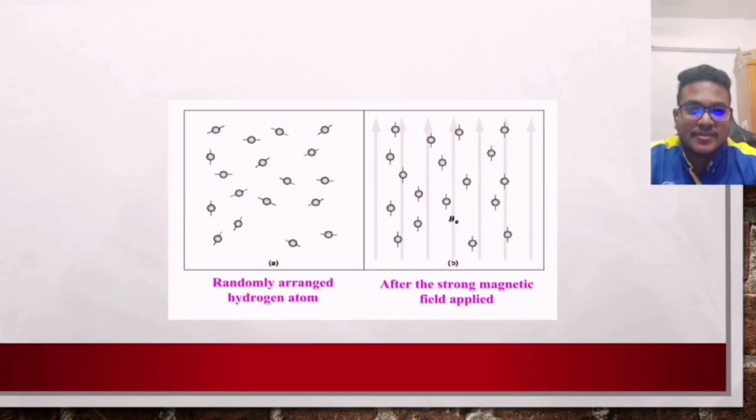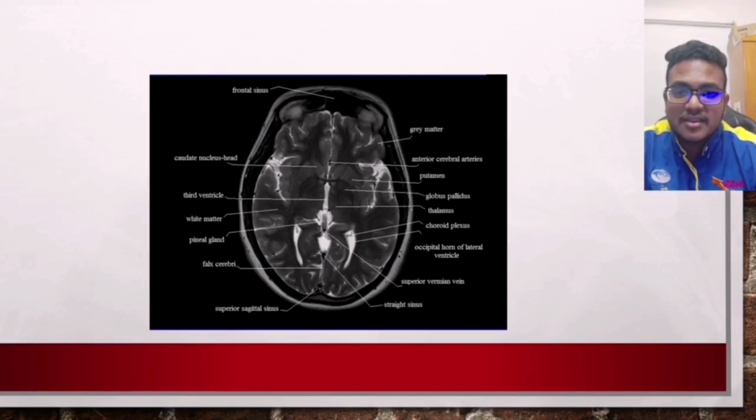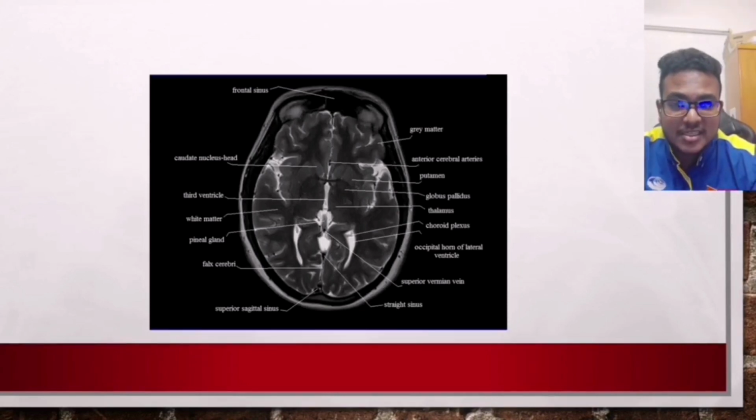An MRI machine can produce cross-sectional images of the organs inside the human's body, such as the size of a tube wall, of an artery, or maybe inflammation of blocked vessels inside the brain. So it can produce a cross-sectional area to identify the problems or any abnormalities inside the organ.